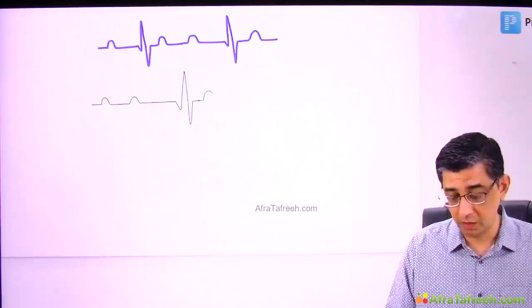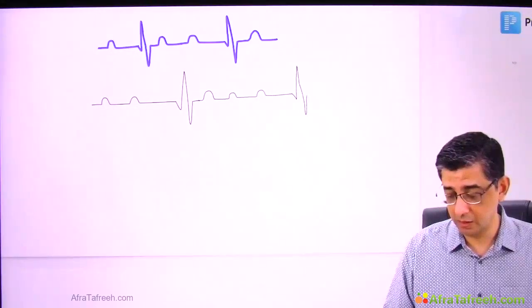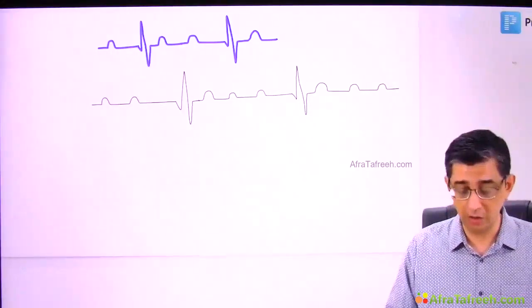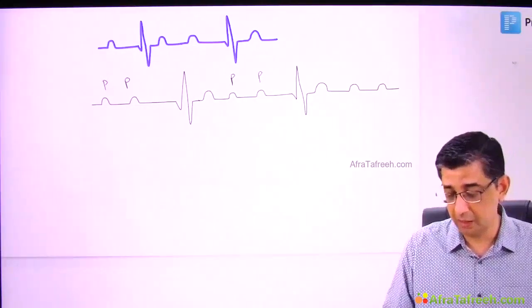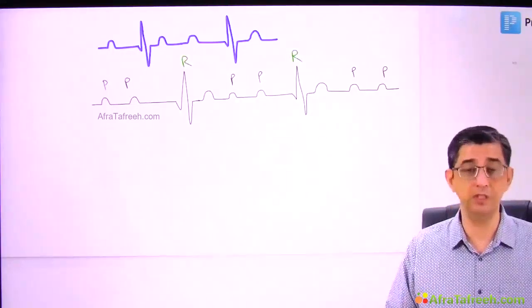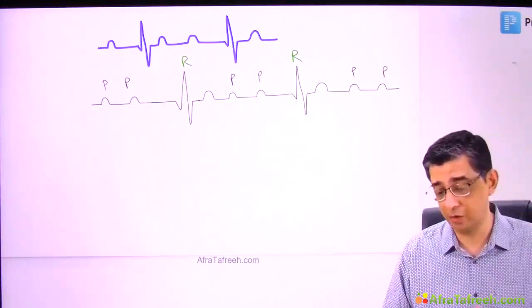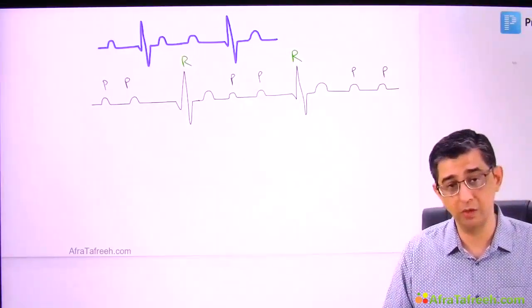You can then notice a T wave coming up, then after P again another P coming up, then I'm waiting for the QRS complex, which is relatively broader. I'm sketching a T wave at the moment, again after P another P wave. Now if you look at the number of the P waves, or the number of times I've just said the word P, it is much more as compared to the R waves present in the ECG of the patient. So one thing that is very striking in this particular ECG is the disparity between the number of P's and the number of R waves or QRS complexes. The duration of the QRS complexes is also broad.